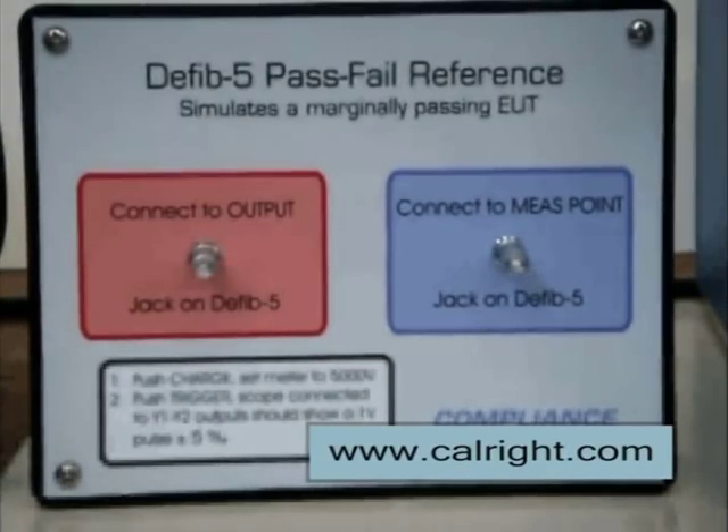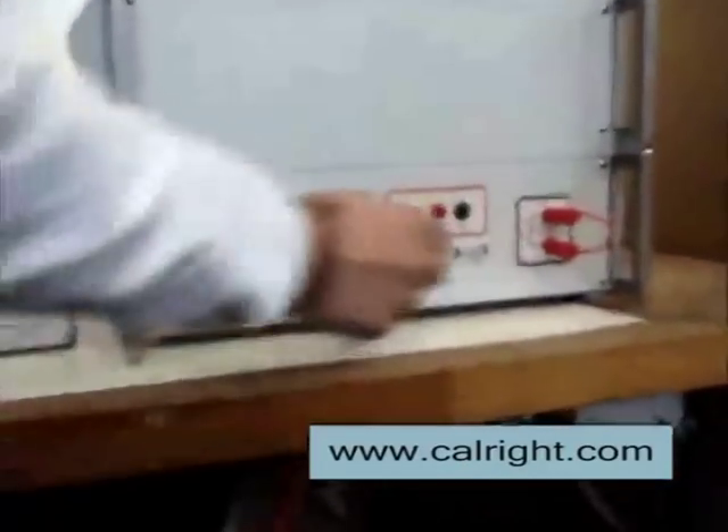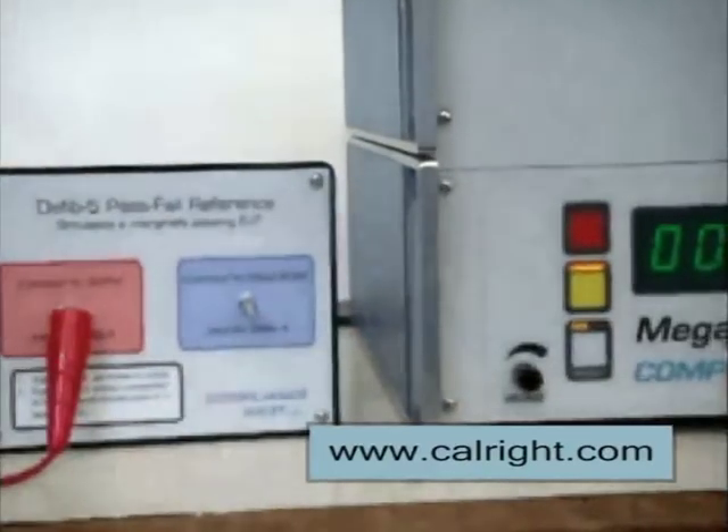Our test setup consists of the D-Fib 5, the pass-fail reference, and an oscilloscope. First, connect the 50-ohm output receptacle on the D-Fib 5 to the pink terminal of the pass-fail reference. The pink terminal of the pass-fail reference represents a patient connection on the device under test.